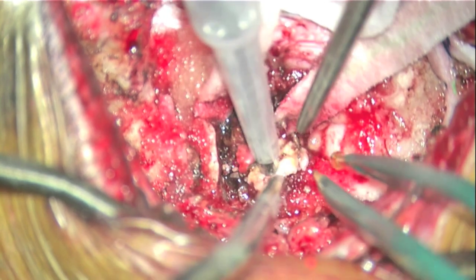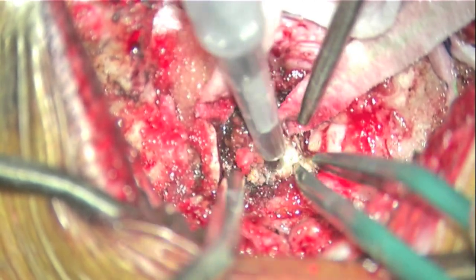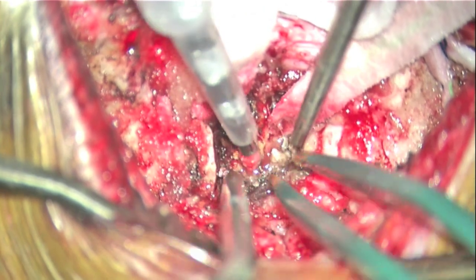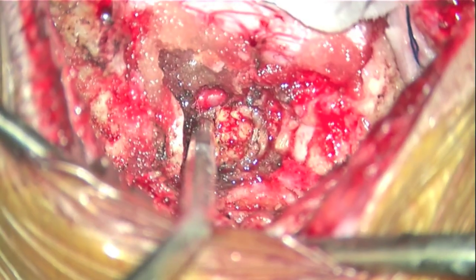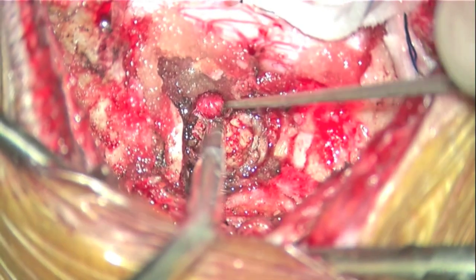Periodic reduction of the tumor mass with an ultrasonic aspirator facilitates visualization and dissection of the ventral tumor margin. Dissection of the tumor margin off the vertebral artery is now complete.